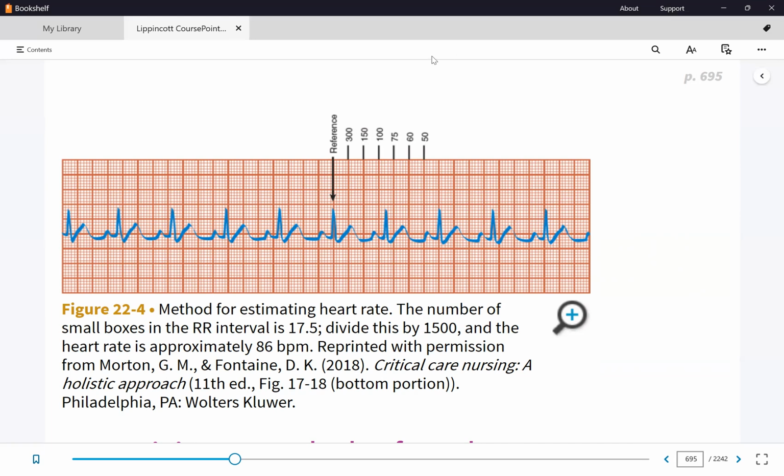But it doesn't really matter. It's up to you. Which R waves do you want to count? Number 6. Oh, you want to choose this one. Okay, so this one, 6 and 7, therefore, yeah?